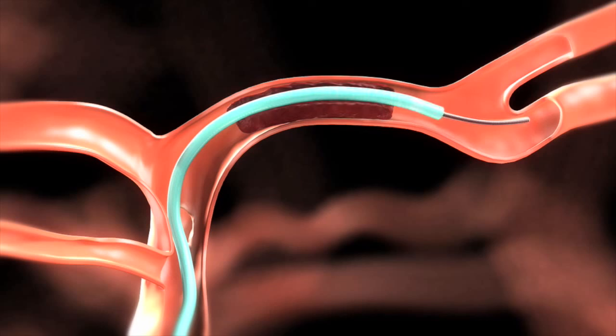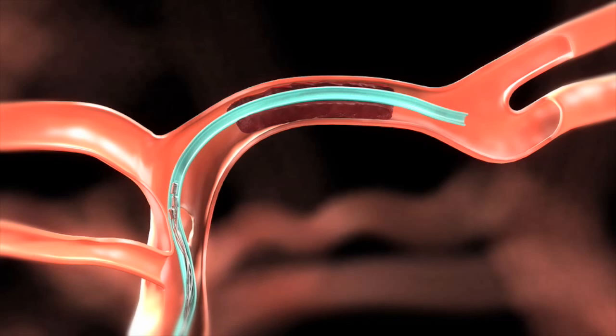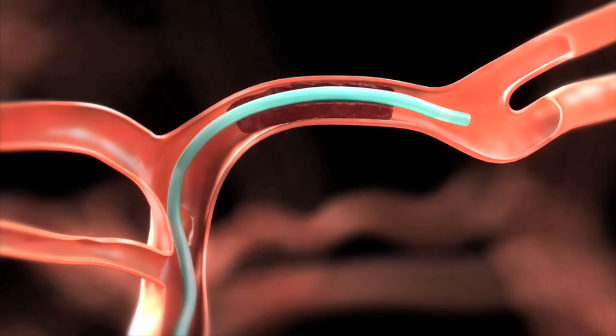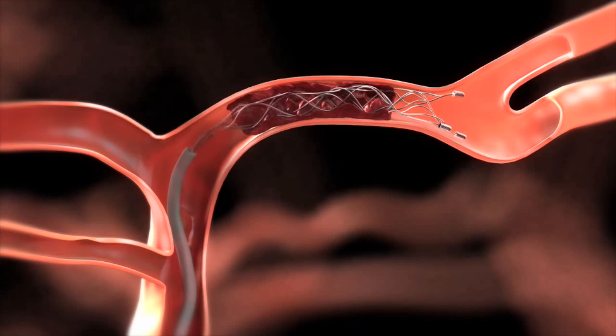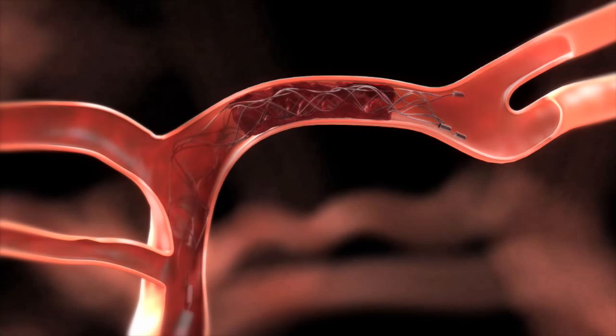Once we cross the blockage, we bring up a mechanical thrombectomy device, which is kind of a stent on a stick configuration. It's a stent-like device that we unsheathe within the clot in the blockage. You can see the stent is opening up and actually restoring blood flow immediately.